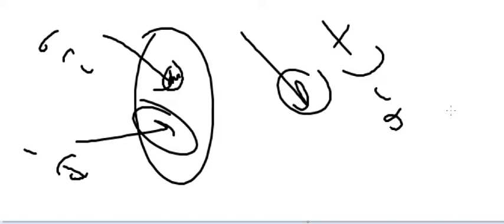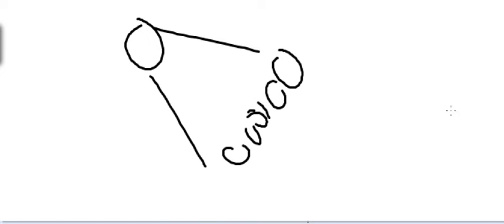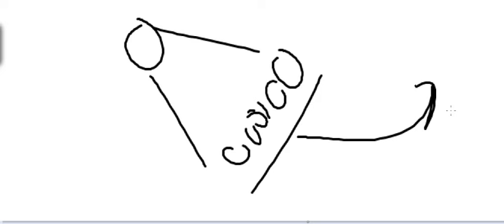Now, I want to talk a little bit about the detectors that are used in CT scan. Last week we said there is a tube and there are detectors. If it is a third generation, the most common, which rotates, the tube gives the radiation to the detectors, the detectors detect things and send them to the computer, and the computer reconstructs the image. This is how CT scan works. These detectors, how many types are there? How many types do you know? There are 2 types of detectors.